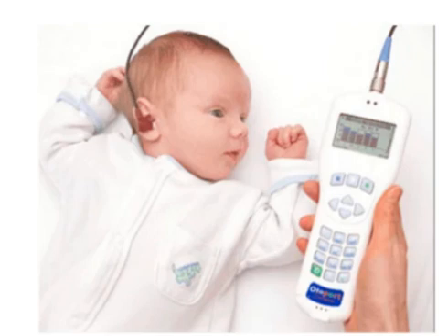Auditory neuropathy spectrum disorder, ANSD. OAE is often used to evaluate retrocochlear pathology within the central auditory system. Since OAE is a measurement of the peripheral auditory system, retrocochlear pathology will present with normal OAE and abnormal audiogram and auditory brainstem response, ABR.